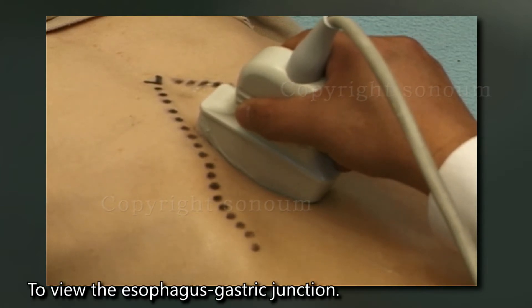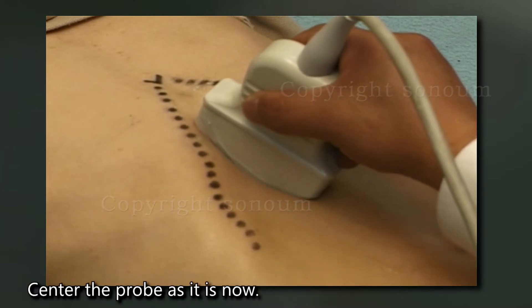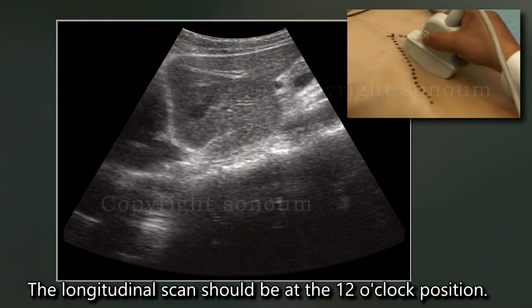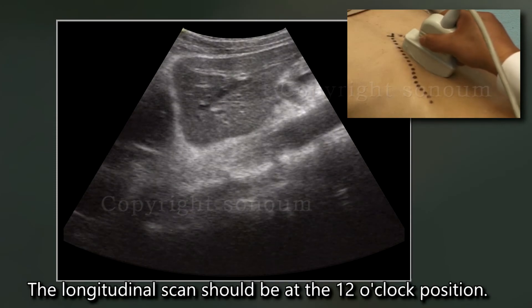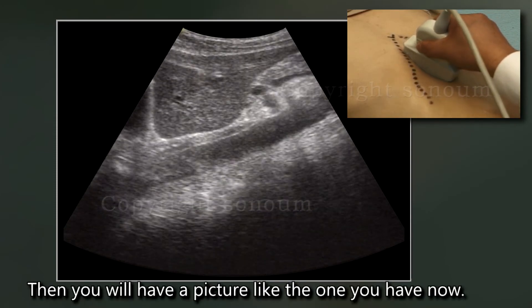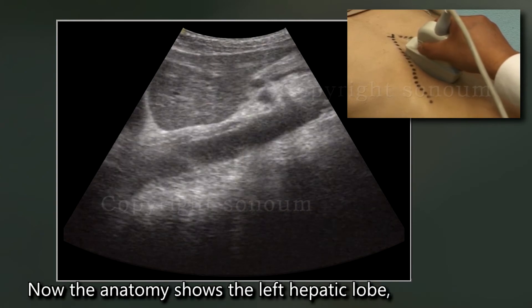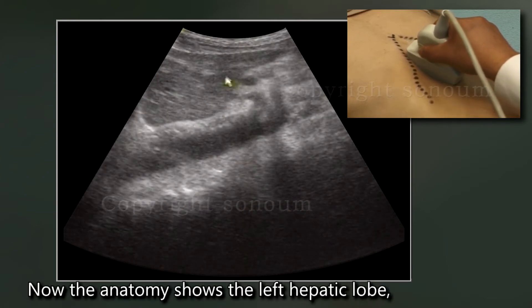To view the esophagus-gastric junction, center the probe as it is now. The longitudinal scan should be at the 12 o'clock position. Then you will have a picture like the one you have now. The anatomy shows the left hepatic lobe.